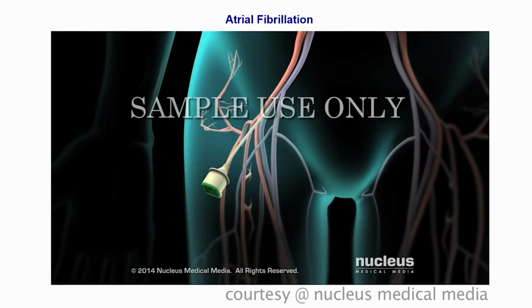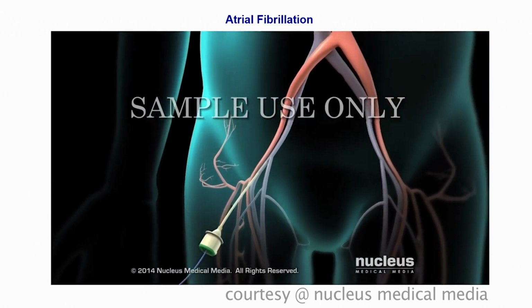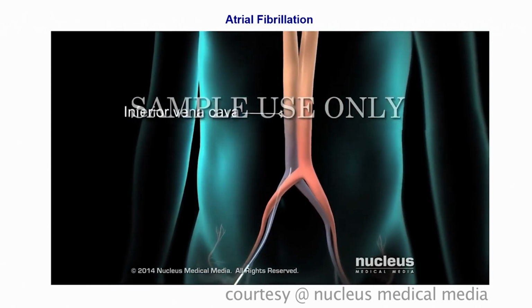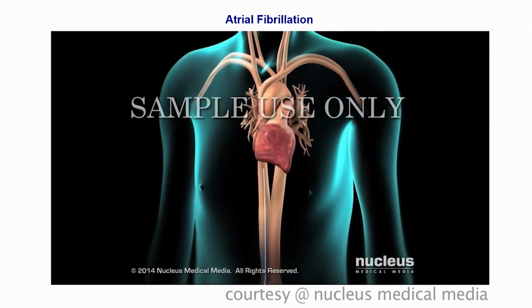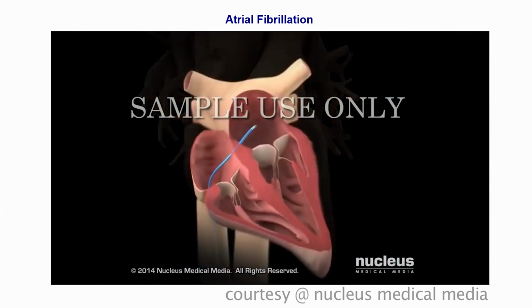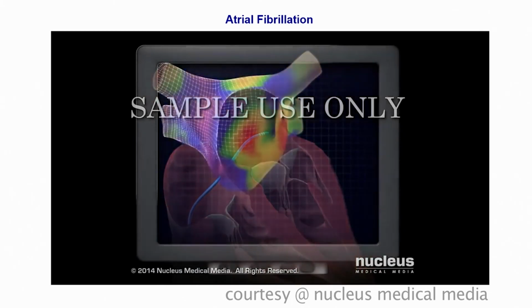Next, a long flexible tube called a catheter will be inserted through the sheath. The doctor will guide the catheter to the heart through a blood vessel that goes to the heart, called the inferior vena cava. The location and progress of the catheter will be monitored.